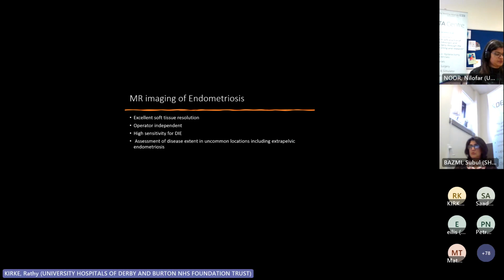I'm going to talk about MR imaging of endometriosis. Now, personally, I think ultrasound's a very, very good first test. But as we progress and as we work with the Endometriosis Center, as we have our endometriosis meetings, and we start looking at patients and getting that feedback, I personally think the MRI adds a lot to endometriosis imaging because it really maps out a lot of the disease.